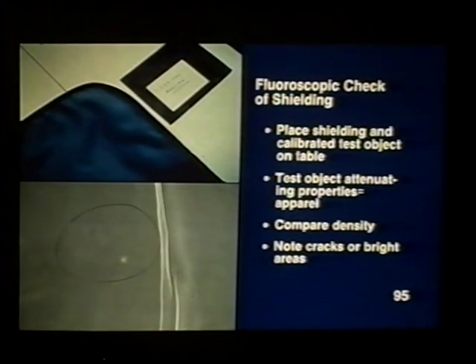This comparison device can be obtained from and calibrated by a physicist. Using mirror optics or a TV monitor, view the items being checked and note whether the items appear as totally dense areas equivalent to the density of the calibrated test standard. Look for light cracks or bright areas that indicate the item is defective.